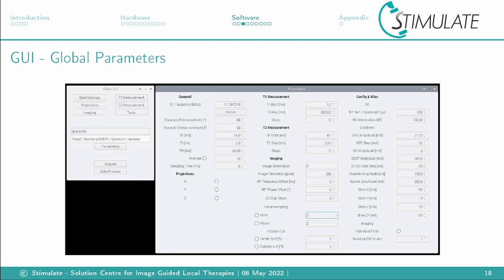These parameters are saved globally and are used in every sequence. You can close the window or even the software, because these parameters are saved in a file and will be loaded the next time you open the window.